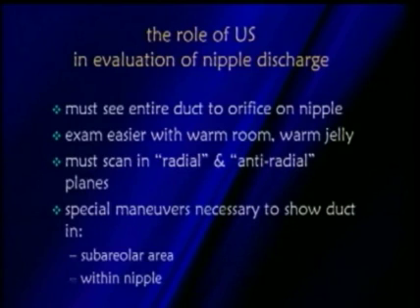Now, when we're imaging patients with nipple discharge, we want to make sure that we see the entire duct to the orifice on the nipple. When we scan, we want to try and keep a warm room and have warm ultrasound equipment. Usually this is not that hard to do. They put out quite a few BTUs. Use warm gel, and then we scan in a radial and anti-radial scan plane.